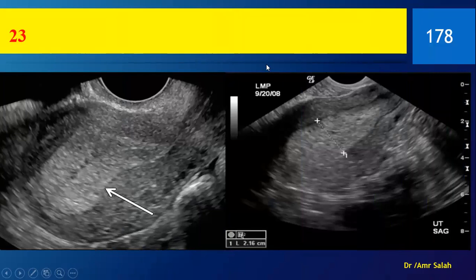What about this? Here, the endometrial thickness is enlarged. It's like 21, and this patient is a middle-aged female. So what I would tell her, this is an increased endometrial thickness for differential diagnosis. Yeah, because it might be caused by pregnancy, hyperplasia, or exaggerated secretory phase, so this is for follow-up and D&C. Okay, great.